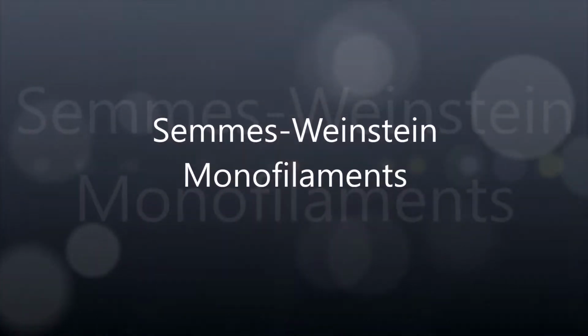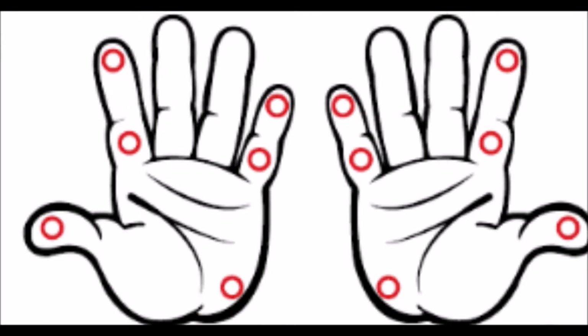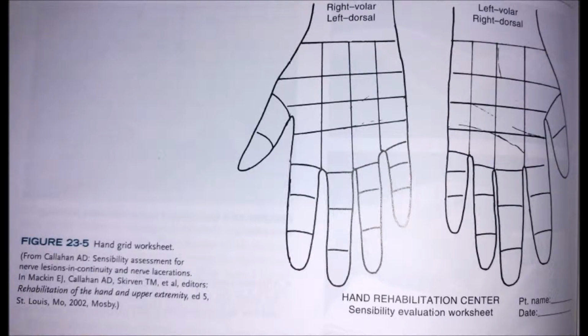Welcome to a demonstration of the Semmes-Weinstein Monofilament Screening Assessment. Throughout this video, I will be referring to the common sites used for the 5-piece monofilament assessment, and then I will be demonstrating how to use this hand grid to develop an intervention plan for my grandpa.